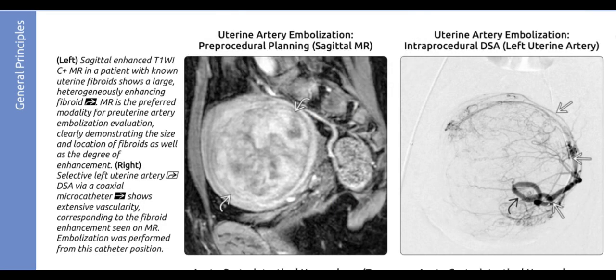Pre-procedural enhanced T1-weighted MRI in a patient with uterine fibroids shows a large heterogeneously enhancing fibroid. MRI is the preferred modality for pre-uterine artery embolization evaluation, clearly demonstrating the size and location of fibroids as well as the degree of enhancement. Selective left uterine artery DSA via a coaxial microcatheter shows extensive vascularity corresponding to the fibroid enhancement seen on MRI; embolization was performed from this catheter position.